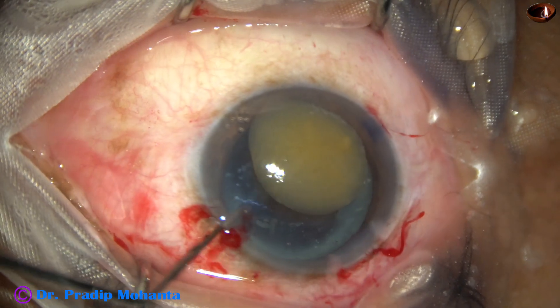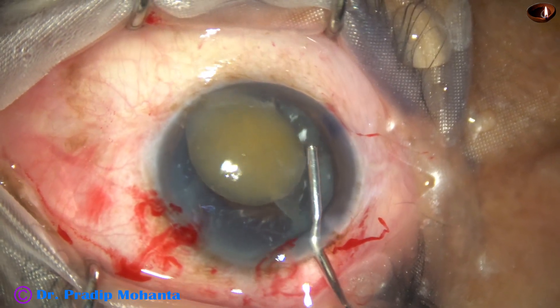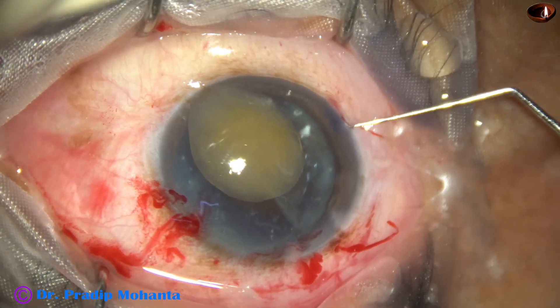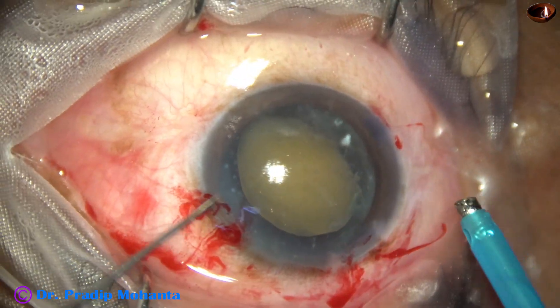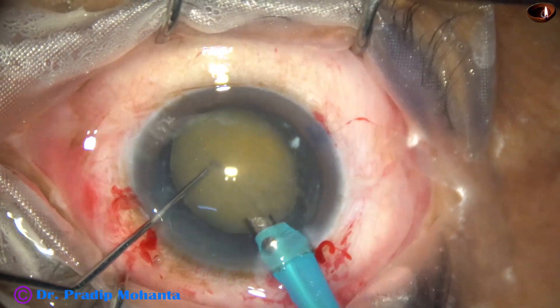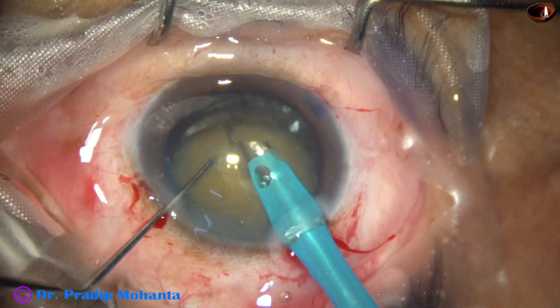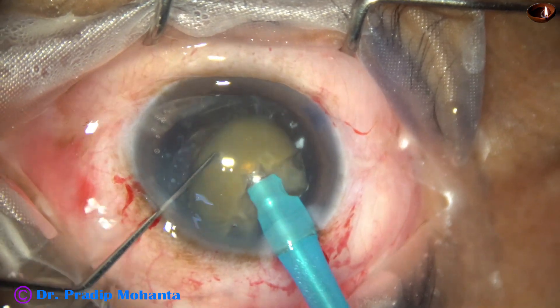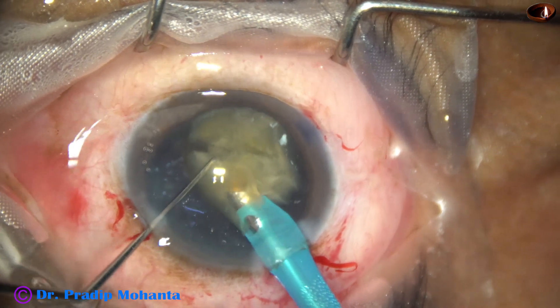Once this is done, I am sure that the posterior capsule will be intact. The nucleus is almost touching the cornea, so I have to bring it down. I use visco and place it at the iris plane with a hook. Now I go with the FACO handpiece. At this time, the vacuum is 400, flow rate is 40 ml per minute and ultrasonic energy is set at 70 percent. Without any fear in mind and with 100 percent protection of the posterior capsule, I could emulsify this lens.